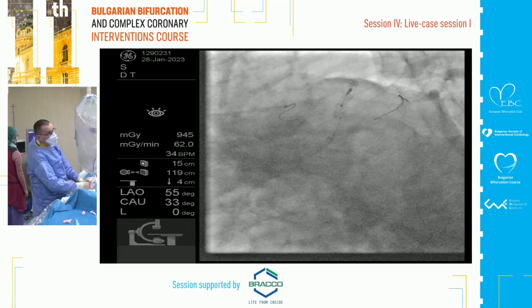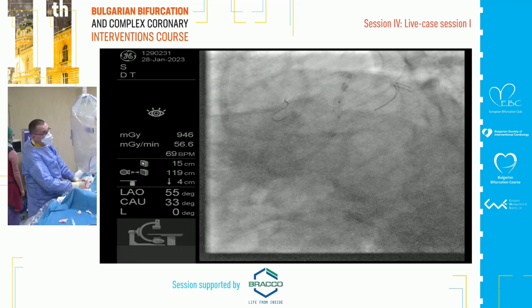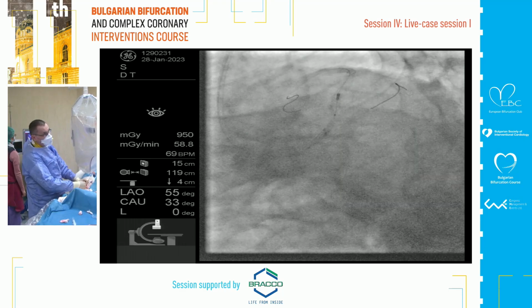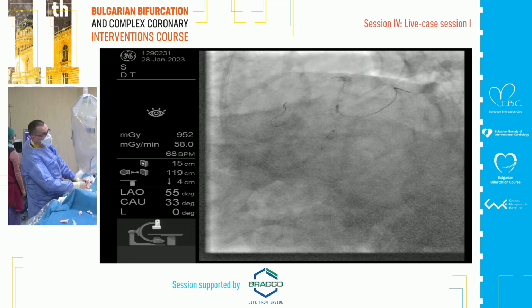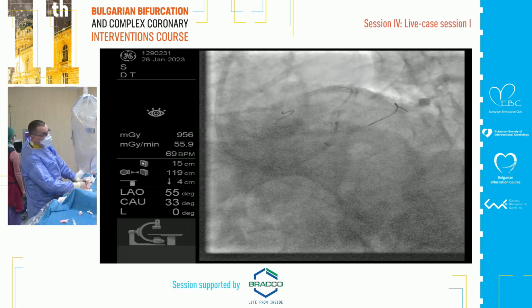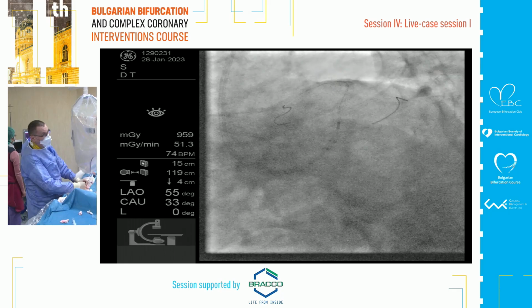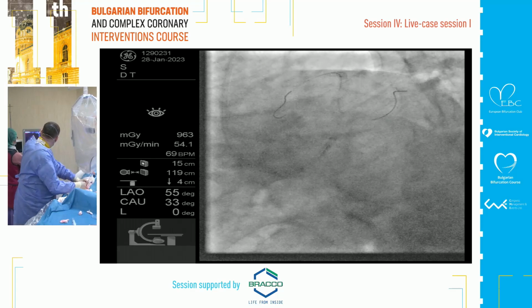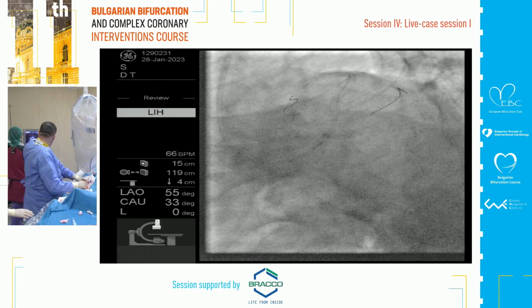I just want to ask you for a few seconds of patience because logistics in the cath lab room is such that I'm obstructing the IVUS picture. Okay, so I'm in the catheter. Okay. Stop.